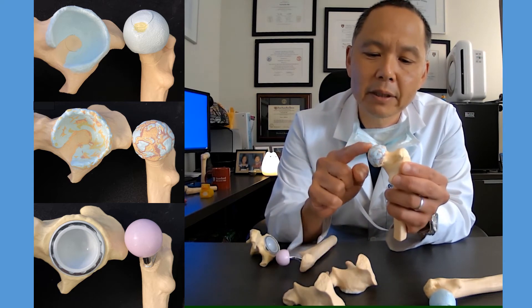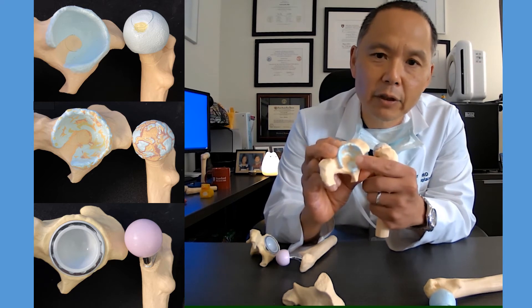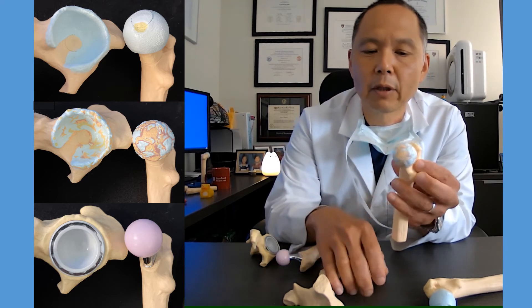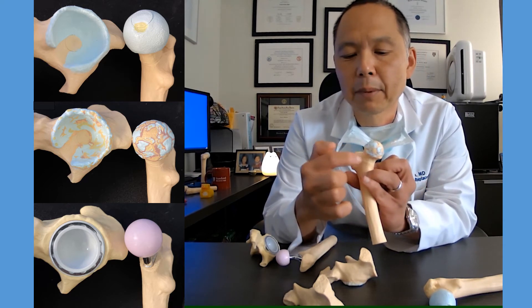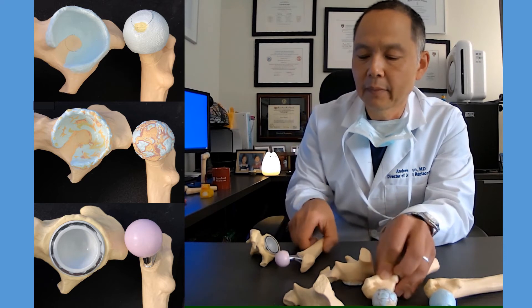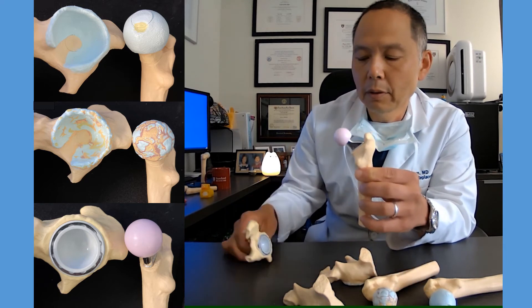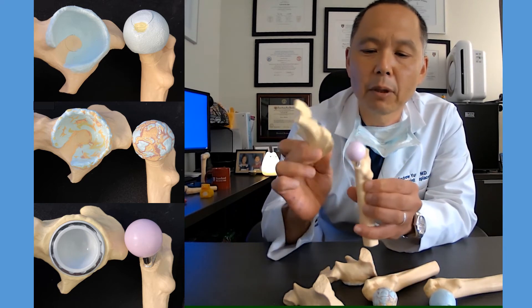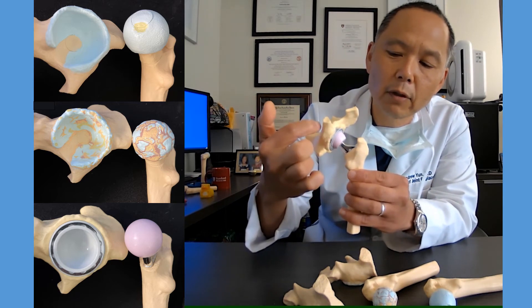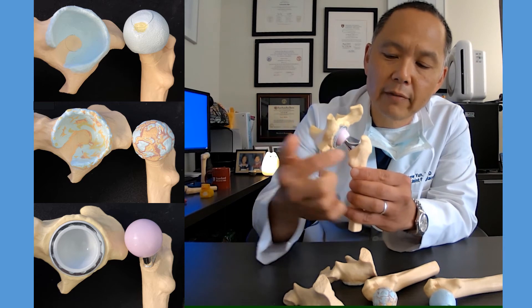When we replace the hip, we just need to replace the ball and the inner surface. We don't need to replace all the bone around the pelvis or all the bone around the femur. We just need to replace this ball, and we do that by removing the neck — you can see where the line is. So we'll replace that arthritic ball with a new ball and a new cushion, so there can be an efficient transfer of load between the pelvis and the femur.